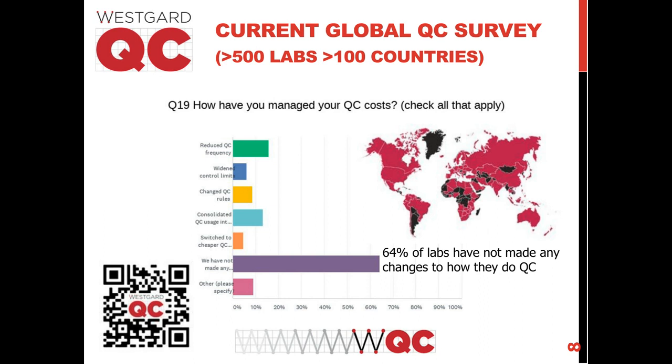And that, of course, is a problem because there's so many changes in laboratories today. If you're not keeping your QC design up to date with your technology, you're probably over QCing, or in some cases you might be under QCing what you're doing.